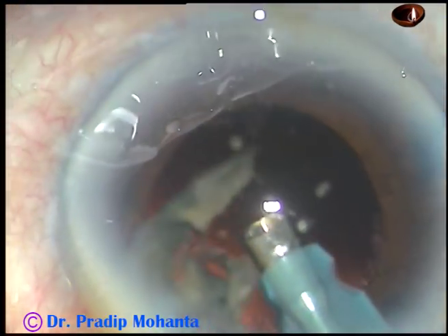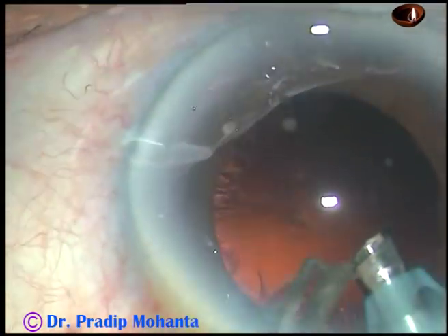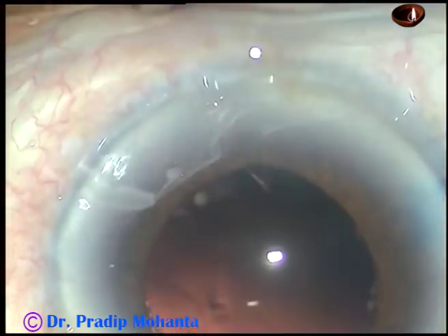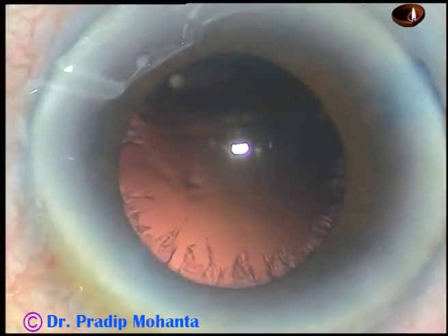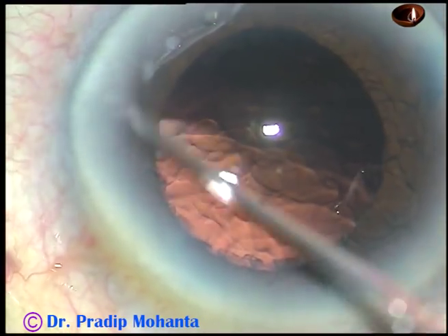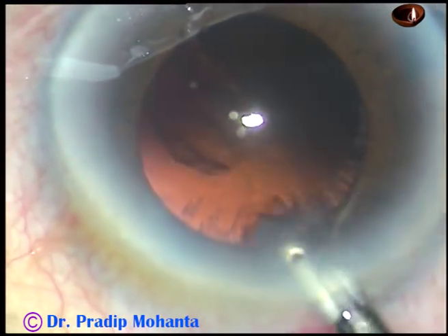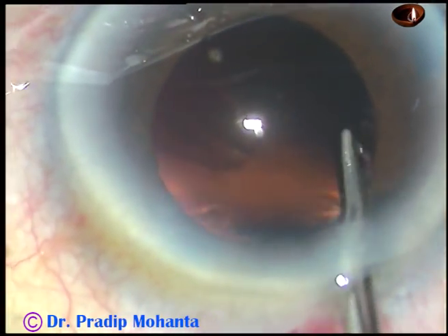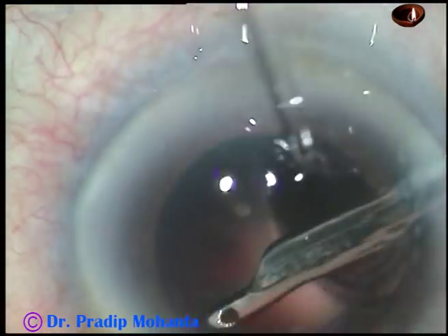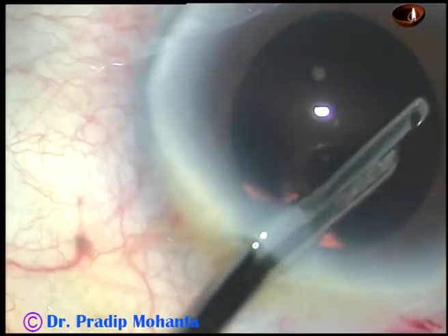You can see the pupil is getting small, but it is still quite adequate to complete the case. Now there is some cortical matter that has to be removed, and there is a beautiful red reflex. I am removing the cortical matter with the help of this 23-gauge Simcoe cannula. I use a 10 cc glass syringe for creating vacuum — this 10 cc glass syringe is beautiful — and cortical clean-up is done.